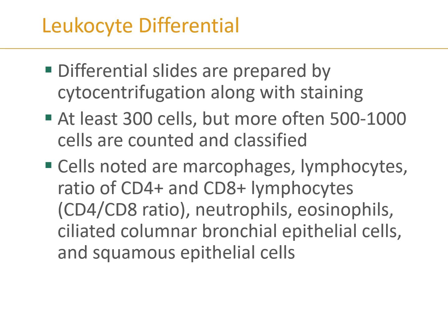Now the book does recommend 300 cells, but typically in a laboratory you're only going to do 100 and get the percentage out of those 100 cells when you're trying to classify the various white blood cells within that sample. And pathology could potentially do more, especially if they're doing any sort of special CD markers or special stains, looking for any sort of malignancy. Then they're going to do a larger count and look at differentiating some of those different cells.